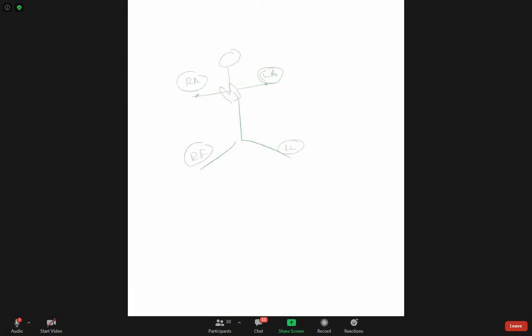So Einthoven came and said, when I attach these leads I'm going to make assumptions to see the ECG. Our limb leads attach to our limbs: right arm, left arm on the distal ends, and left foot and right foot.